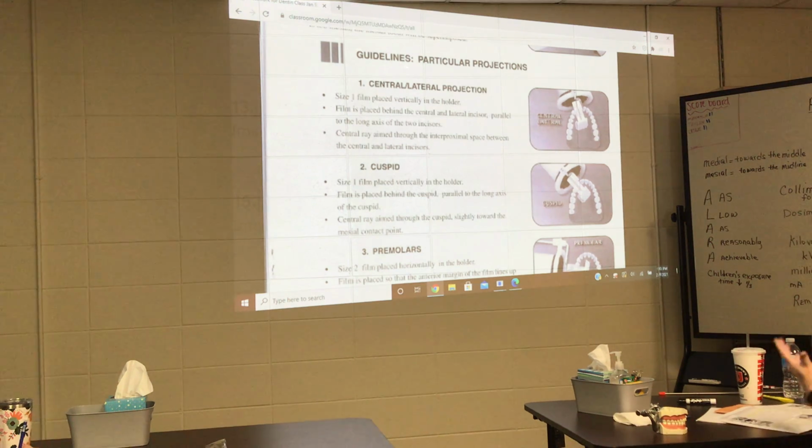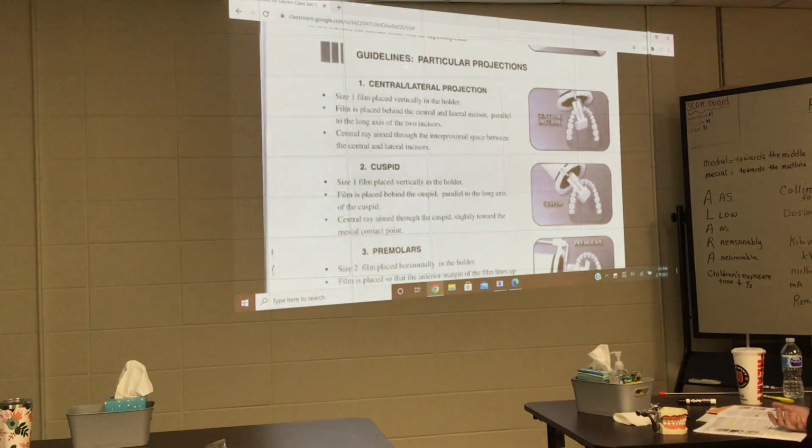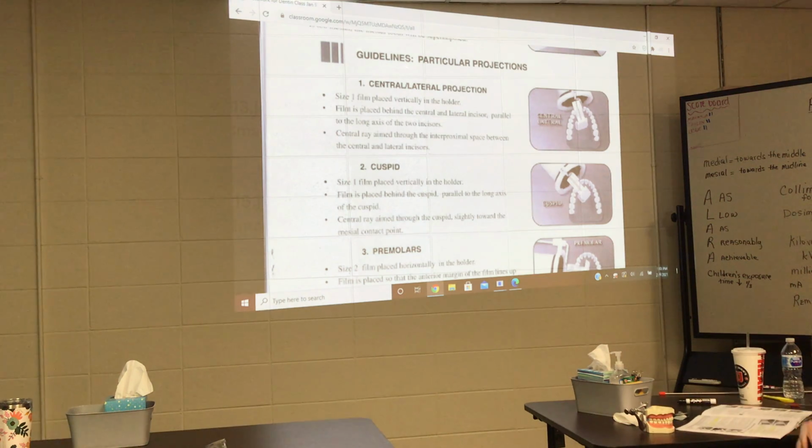we start. The reason that it's thought that you should start with the anterior teeth versus the posterior teeth is where are you going to be the more gaggy? Posterior. So if you start in the posterior and you trigger the gag reflex, you're kind of lost from the very get-go, is what the thinking is. Whereas if they're more comfortable and less gaggy in the front, you can gain their confidence, and by the time you get to the gaggy part, well, we're almost done. And that's a very true and valid point, but there's all kinds of different ways you can alleviate gagging once it starts.